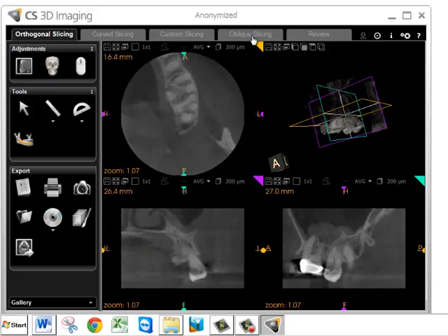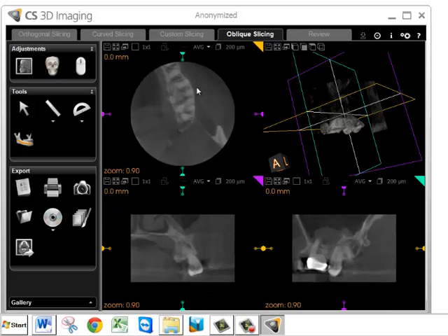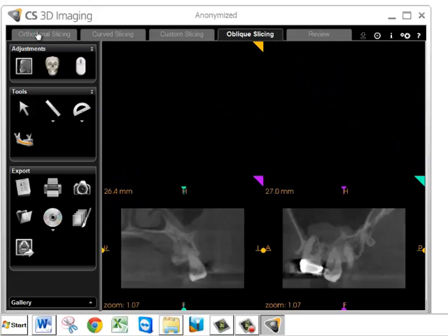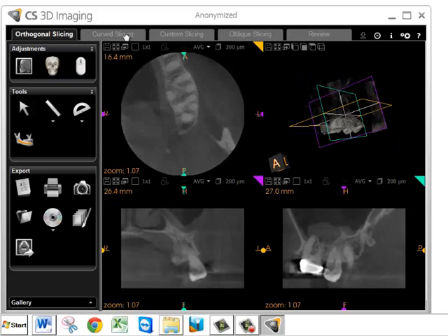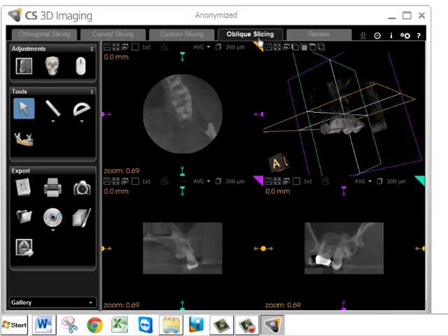If you're evaluating the volume for pathology, endo problems, perio problems, or oral surgery, I recommend that you mostly use the oblique slicing window. You have the orthogonal window, the curved slice, and the oblique slice. So let's concentrate on the oblique slice now.